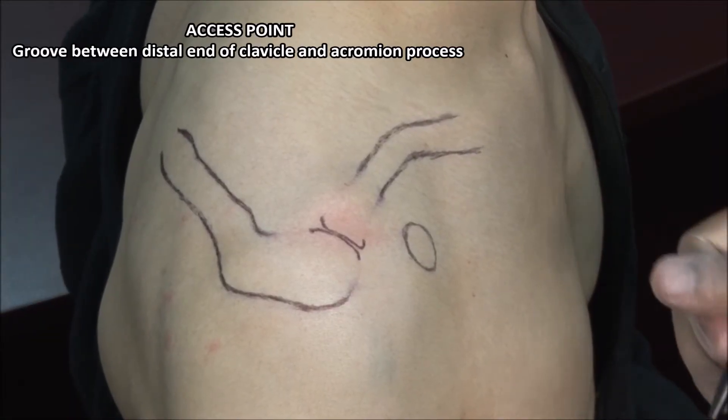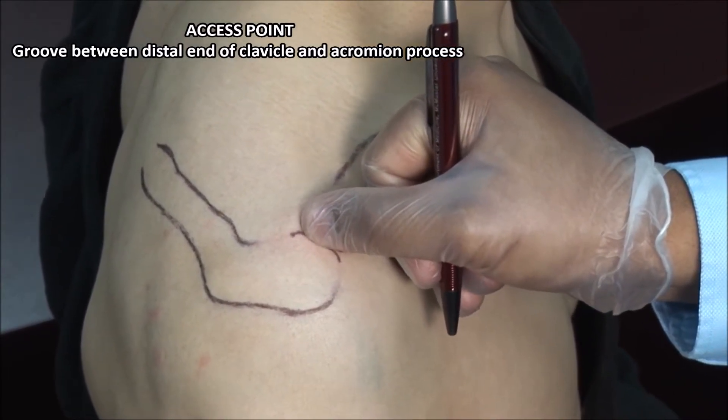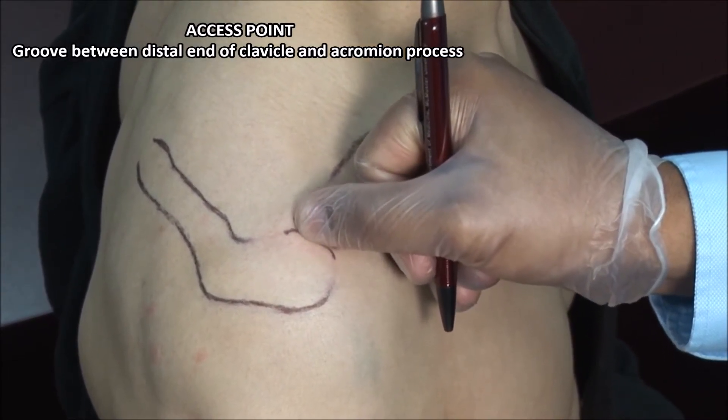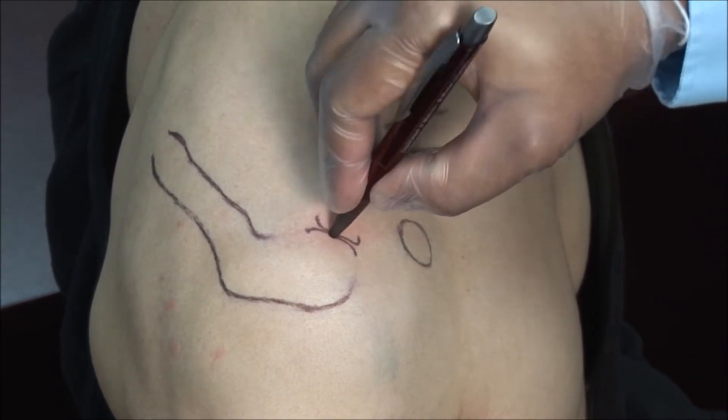The acromioclavicular joint can be felt as a groove just where the clavicle meets the acromion process. Using the tip of your thumb, palpate the joint space and use a retractable pen to mark the point of injection.